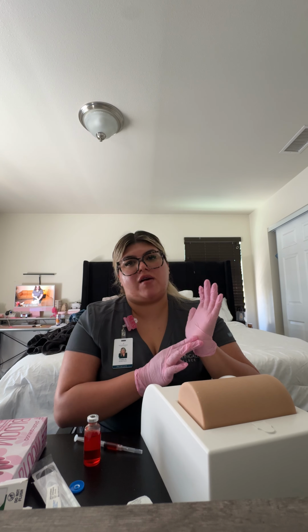We're going to set this down, and now we're going to have the patient lie on their side with their hip exposed. Our injection site is going to be the ventral gluteal site. So what we're going to do is put the palm of our hand down at the greater trochanter, and our thumb is going to point towards the patient's groin, and then our pointer finger is going to be at the anterior superior iliac spine, and then our middle finger is going to point towards the iliac crest. So it's going to form this V here, which is going to be our injection site.